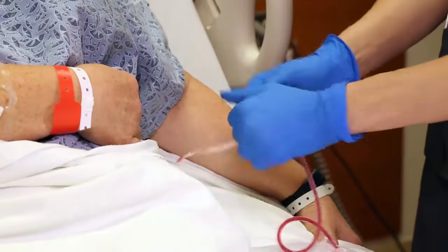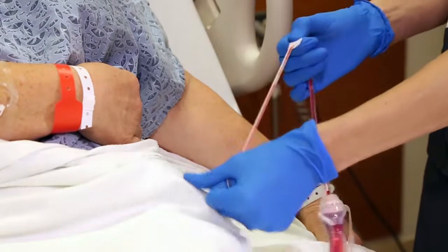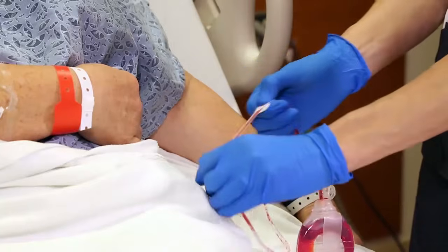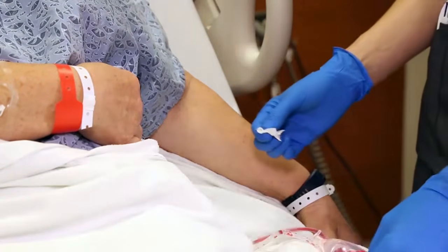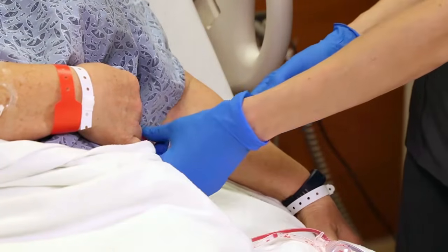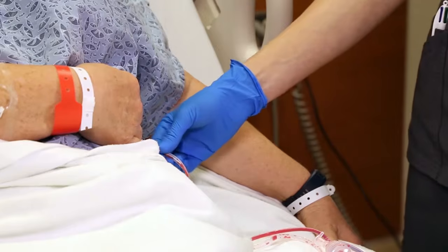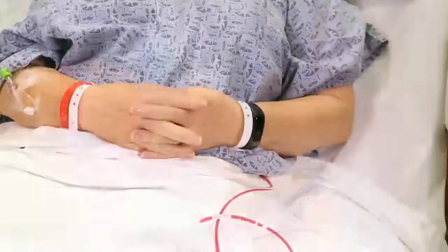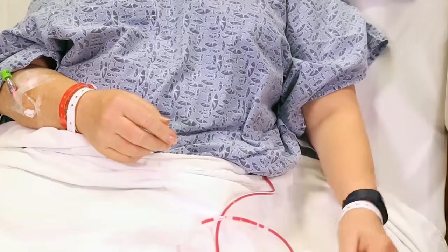As you move all the way down the tubing, you're clearing any clots and material from getting caught in your surgical drain system. We always hold the tubing close to the body to prevent unnecessary tugging that can be painful to the patient. Now that you've washed your hands, it is your turn. Please show me how to use the drain stripper and the alcohol pad.